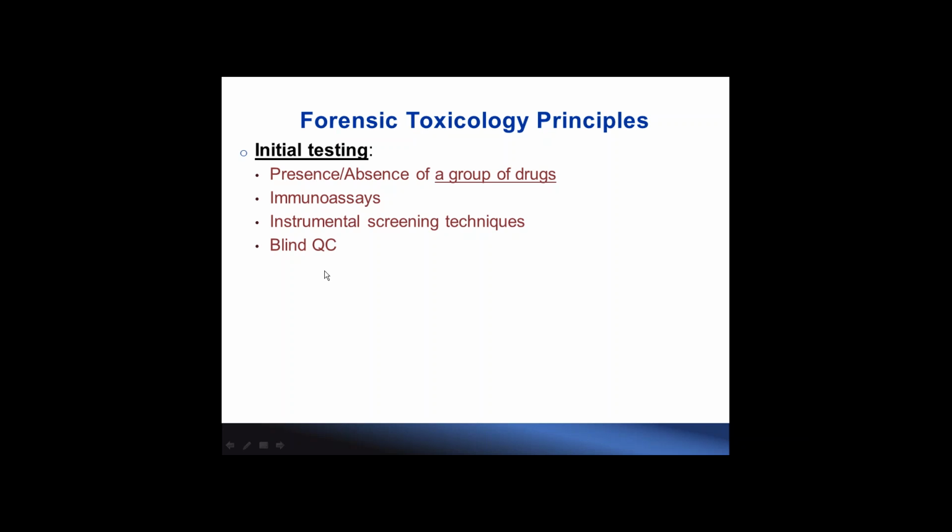And blind QC is quite an important concept under this stage of the testing. What it is, is the type of quality control where we know what the test results are behind the scene, but it is blinded from the analysts or technicians who are handling the batch until the data reviewer receives the data to review it.